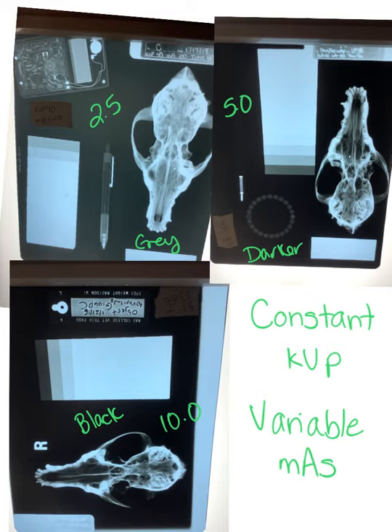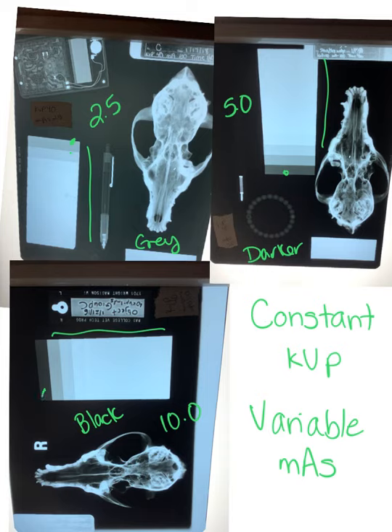You can also look at the step wedge on all three of these. There's not a ton of change, but the blacks on one, two, and three just get blacker. The darks get darker and the blacks get blacker as we go through changing MAS.